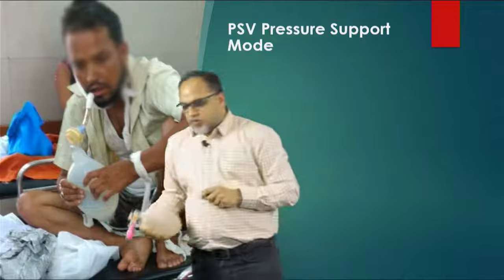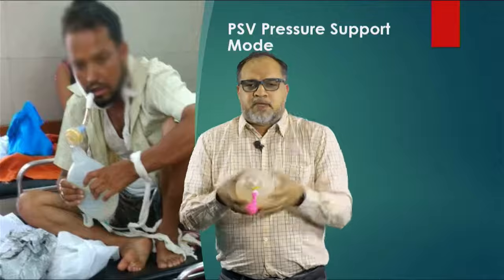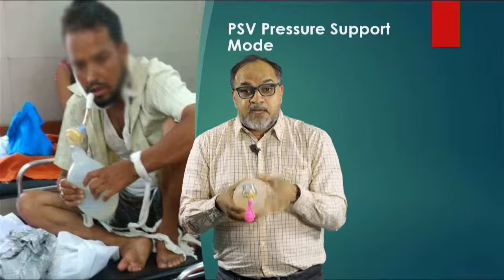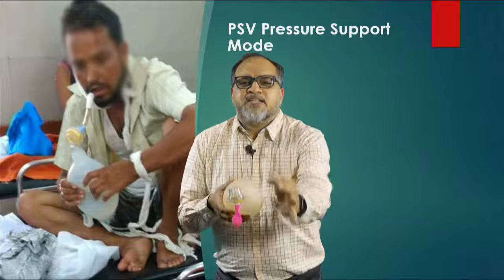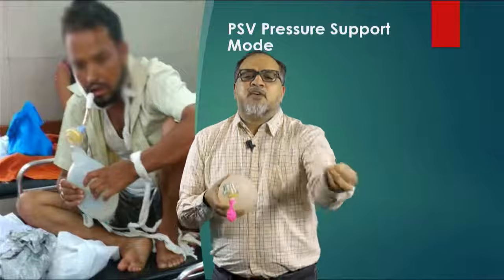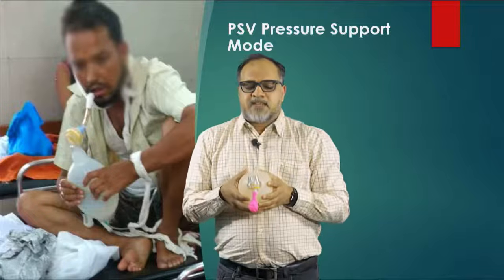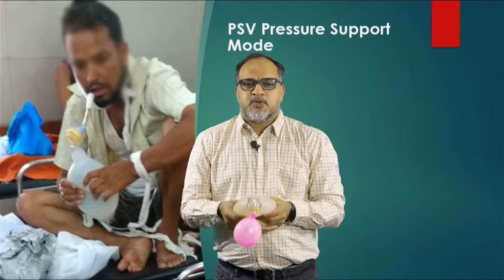In pressure support mode, how does it work? The ward boy is with the AMBU bag. The patient is not breathing. Now the patient triggers. The ventilator supports with a positive pressure of, let's say, 15 or 12 or whatever number you set. Right? So everything is silent. The patient tries to breathe. The ventilator supports with 15.